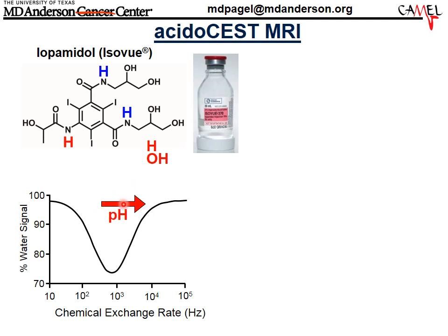So as pH increases from an acidic to a more basic or alkaline pH value, the chemical exchange rate from this proton will increase. And that's seen in this chart for the proton right here in red, and then also for the proton in blue. The range increases from something that is relatively slow to a more intermediate exchange rate.